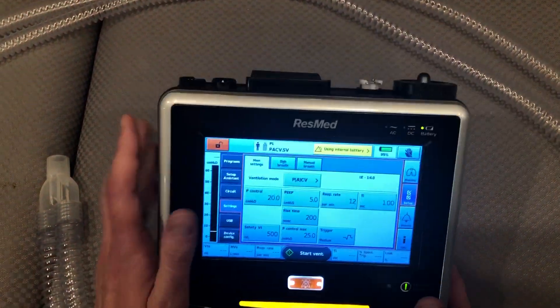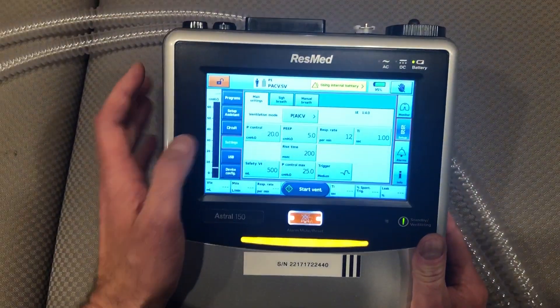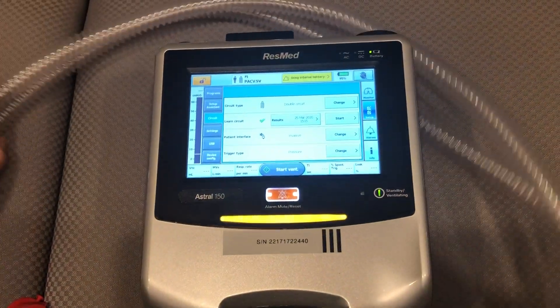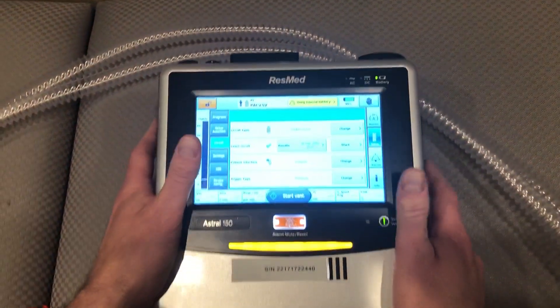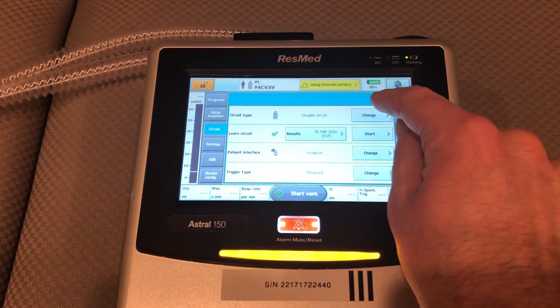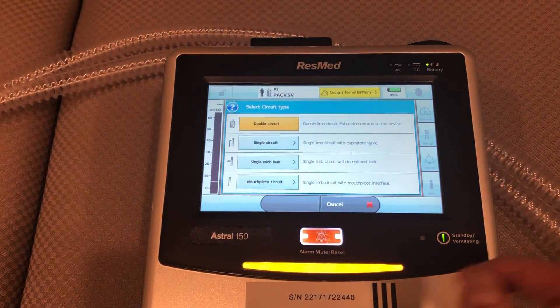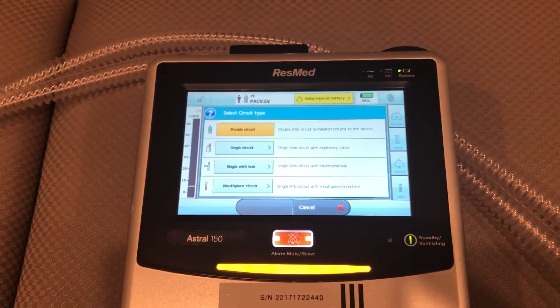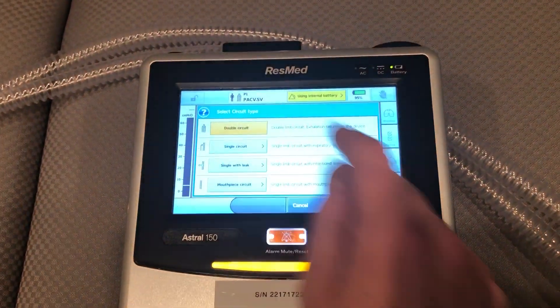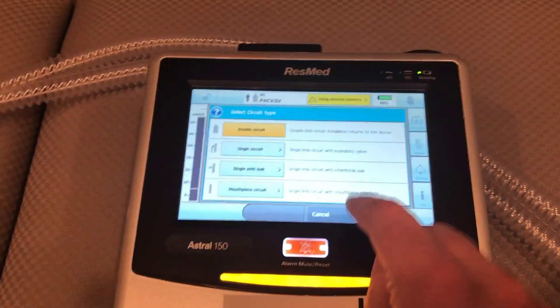You'll notice on your left there's a button that says 'circuit' — I'm going to press that. Our circuit type says 'double circuit,' which is what we're going to be using. You can press the change button and you'll notice that you could use a single circuit, a single with leak, or a mouthpiece. But again, we want to use the double circuit.